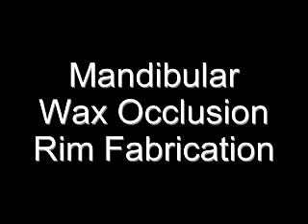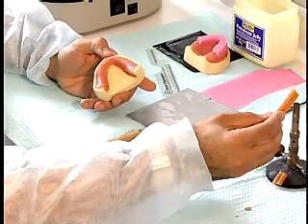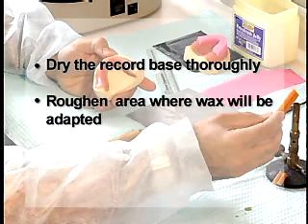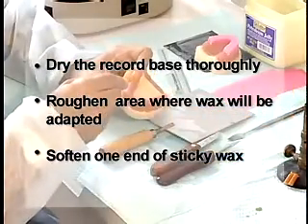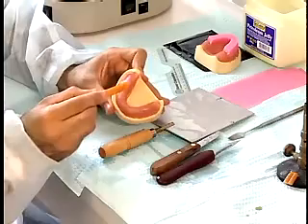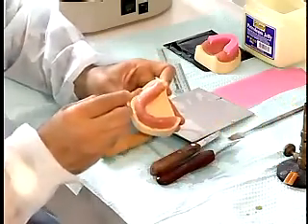The procedure for making the mandibular rim is very similar to that of the maxillary rim. Dry the record base thoroughly, as wax will not adhere to a wet surface. Roughen the area of the record base where the wax will be adapted. Soften one end of the sticky wax slowly over a Bunsen burner flame. Place the sticky wax over the ridge crest area of the record base.